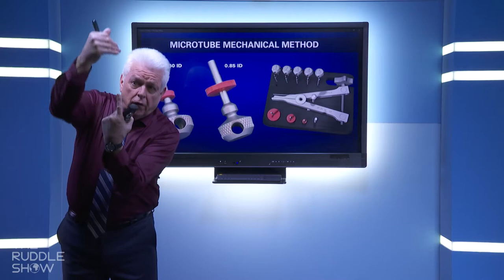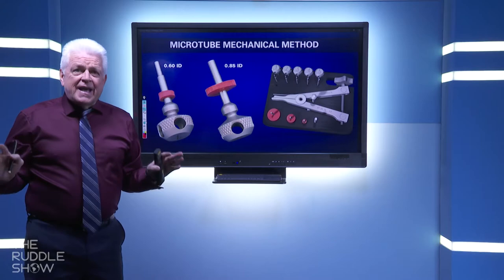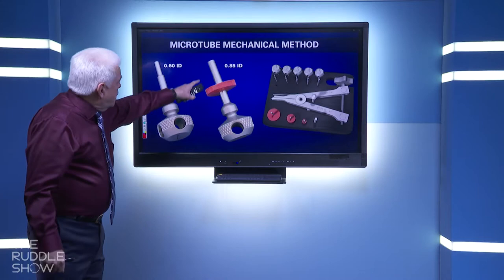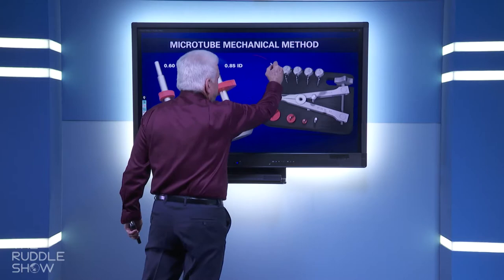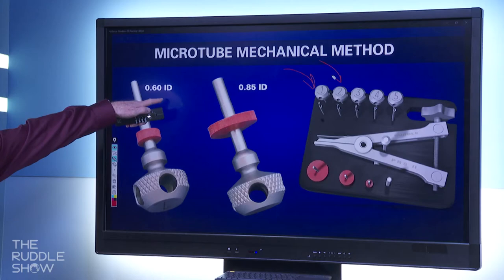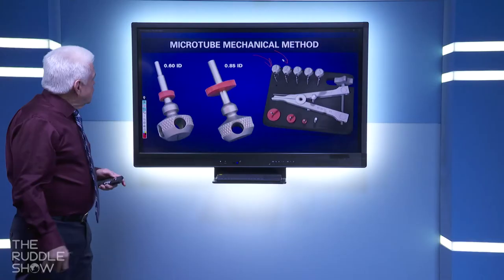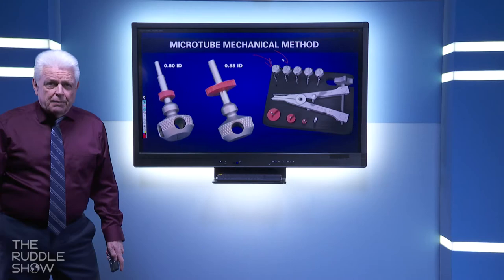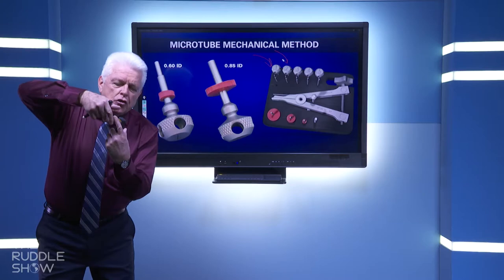I'm not going to talk about those, but I use that idea a lot in wispy silver points, the really small diameter ones, the ones that you don't want to start wiggling the head of or you might break it. So I want to introduce another kind of tube, and it comes right out of this kit. This is the number one, and this is the number two. And what's important is the ID, in this case, the inside diameter. So any silver point that's sticking up into the pulp chamber that is greater than 0.6 millimeter, that means almost all of them, you can tap it. It's very soft silver. You can turn counterclockwise. This tap turns.